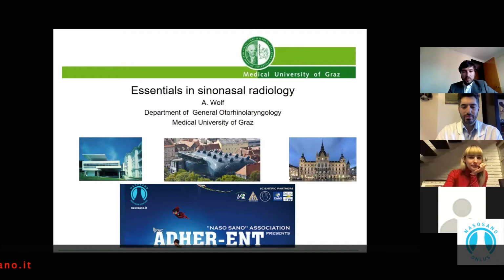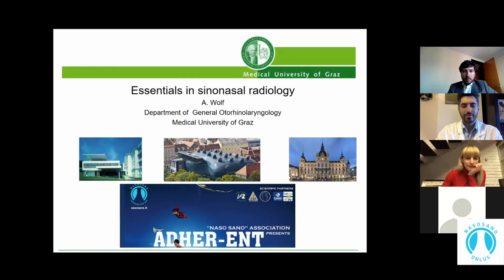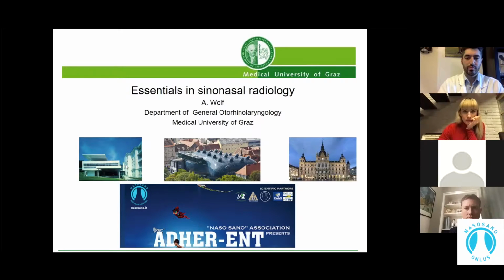The aim of my talk now will be to talk about some radiologic imaging techniques in general. Furthermore, I want to go into detail to present our CT checklist to give you a structured plan to go through CT scans and give you, of course, some clinical examples why certain points are important in my point of view.